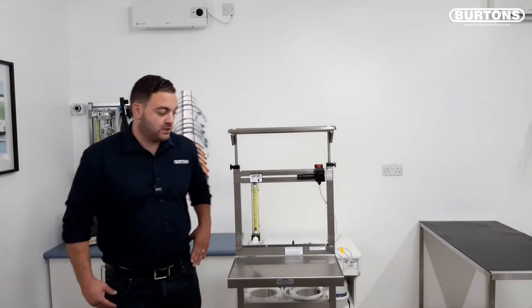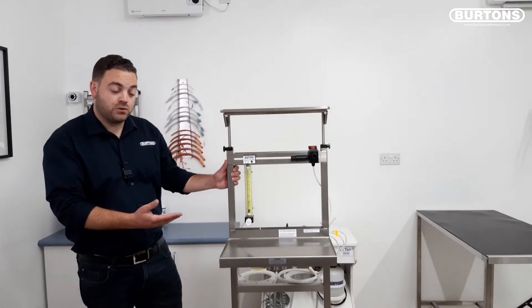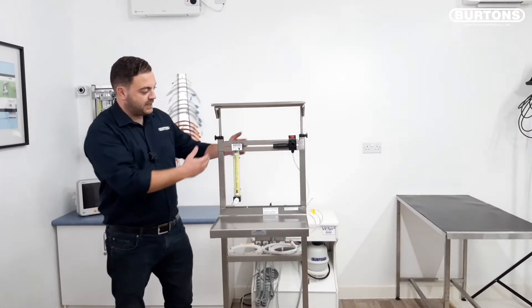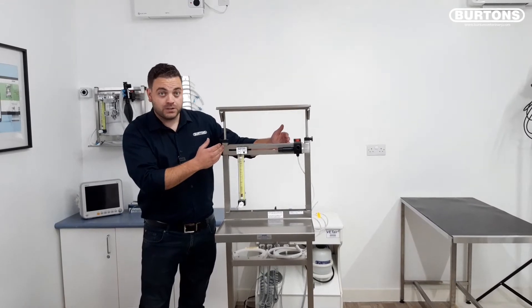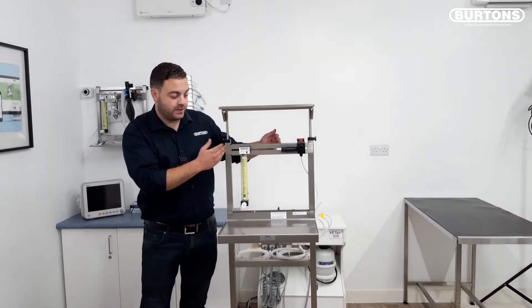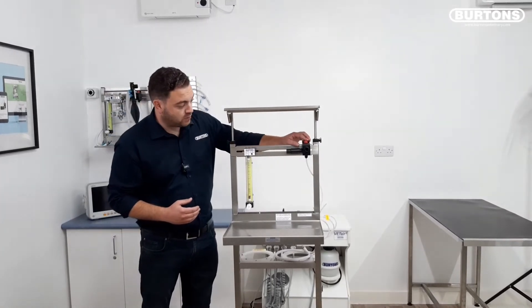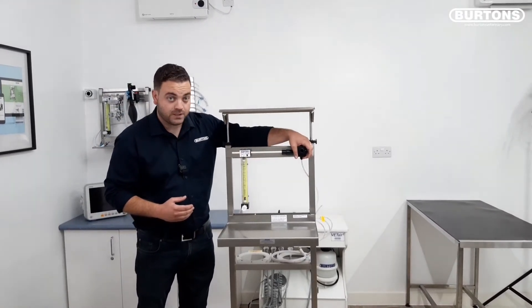Moving on to the Burtons AAA machine, the adaptable trolley. As you can see it's similar in principle to the wall mounted machine. It has the space to accommodate two vaporizers should you wish — isoflurane and sevoflurane. It comes equipped as standard with the high accuracy rotameter and the corner flush unit with pressure release valve.